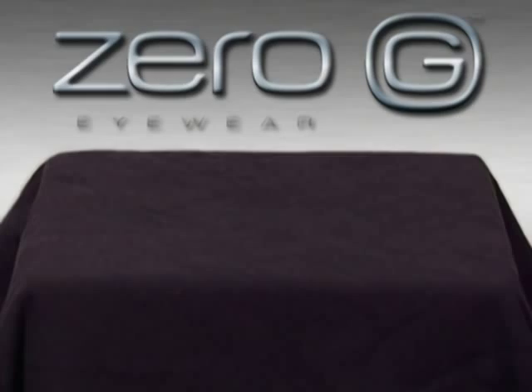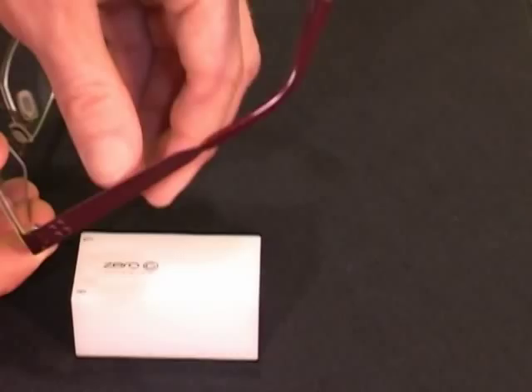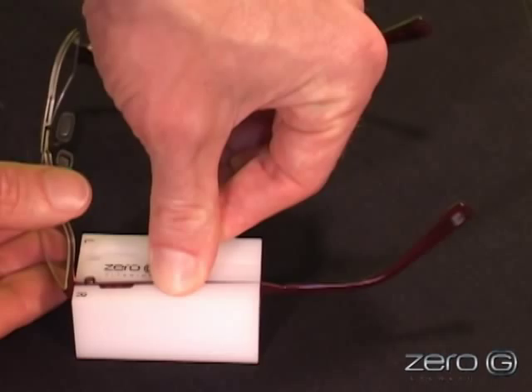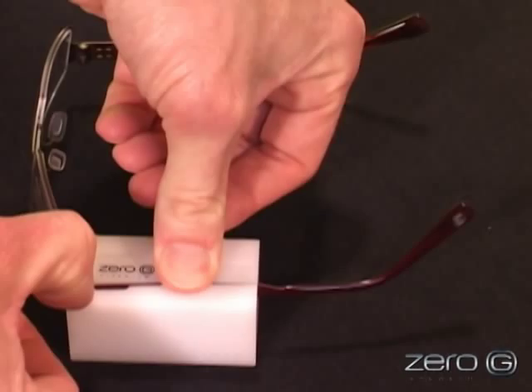Place the resin plate on a hard, flat surface. Turn the frame upside down and slide the right temple into the R cutout. Make sure the temple is completely inserted into the cutout and the bottom edge of the temple is flush with the top surface of the resin plate.